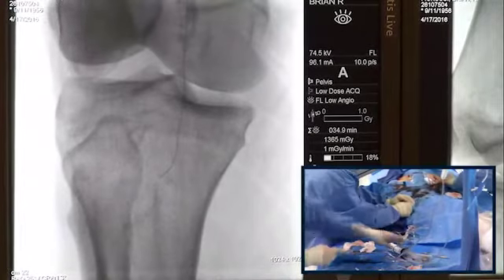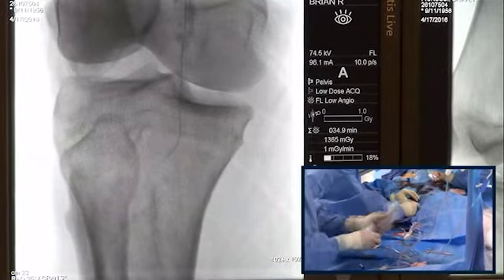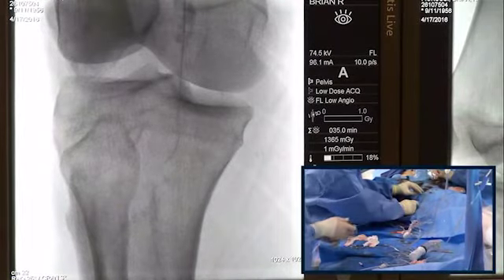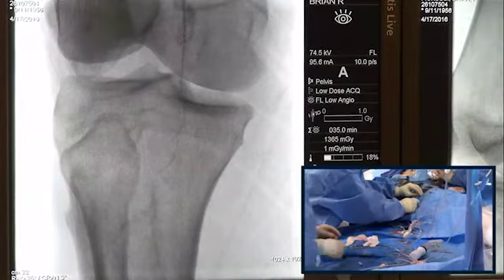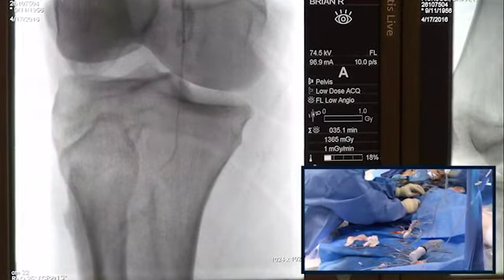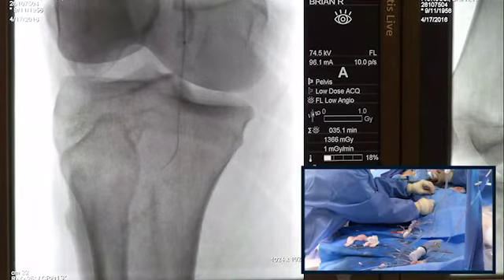So we are here now. Why don't you, Andy, see if that NaviCross goes down a little bit more, and then we can take a picture and get a sense of what's going on back down here. If you can rotate it, also it will go. Okay, that's perfect. Actually, come a centimeter more. Rotate it and push it down a little bit.